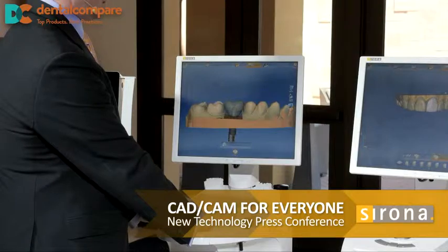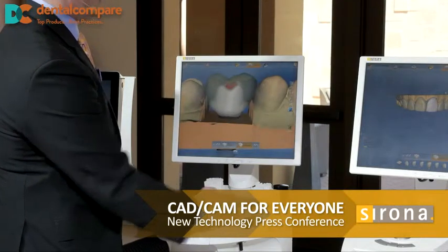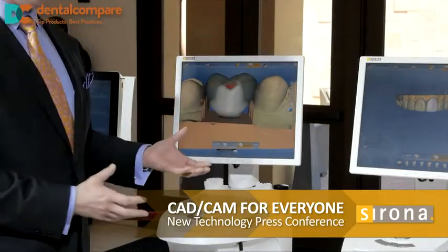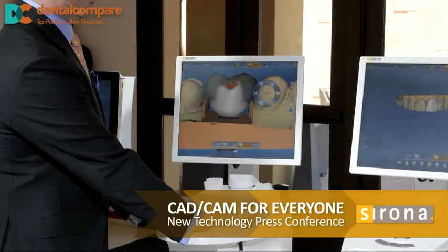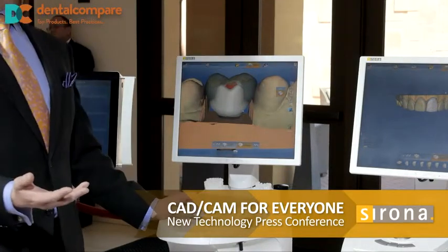Darren, would you zoom in on that model a little bit so that we can see? There we go. Then we can create our abutment directly underneath our crown based on parameters that we've already set up. Then we can manipulate the abutment if we need to change anything. We can change it with our tools just like we would our crown.